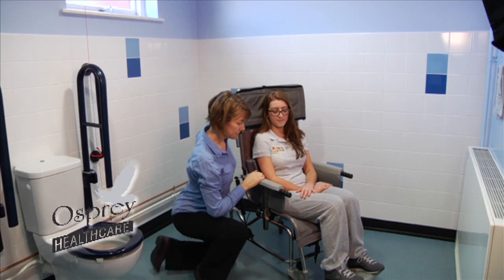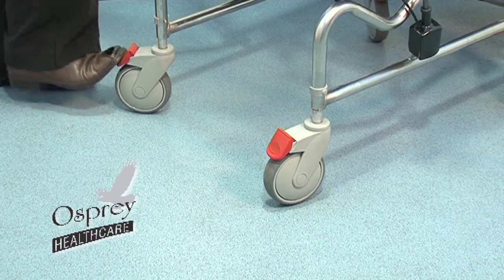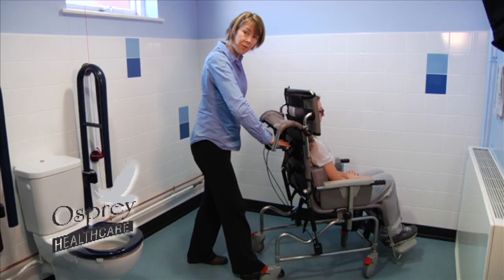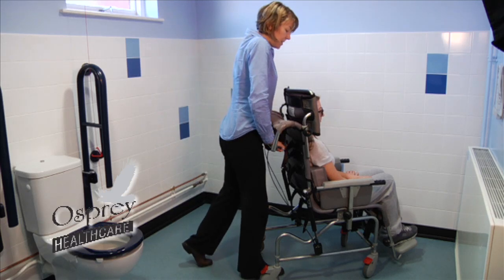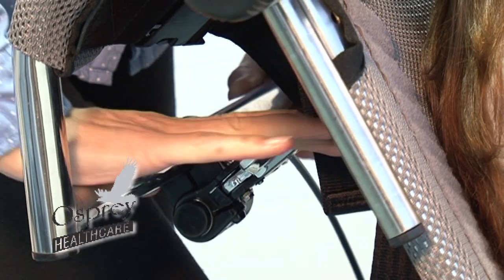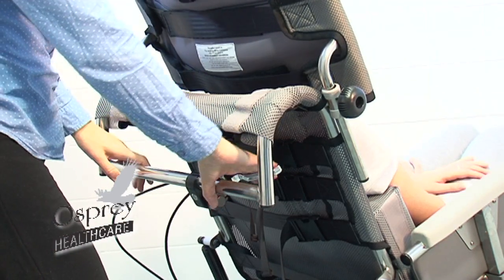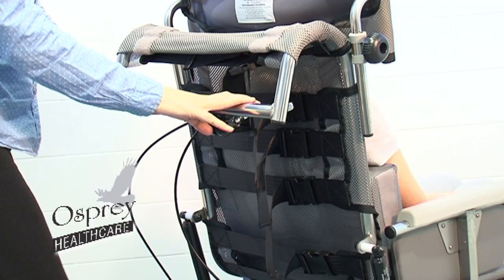We're going to look now at the tilting mechanism. I'm just going to turn the chair around so that you can see what I'm doing, and it's important to put the brakes on at this stage. There's a handle here, very much like a bike brake handle, and as you pull that towards you and lean down through the back of the frame, the chair will tilt backwards. It's important that you get a nice position where you use your body weight to release and push. When I've finished showering and want to bring Emily back up into a sitting position, it's a simple matter of pulling the brake lever, and the chair will almost bring itself back up into an upright position through the use of the gas struts.